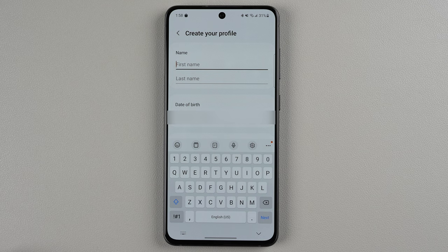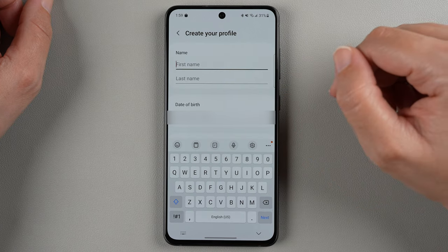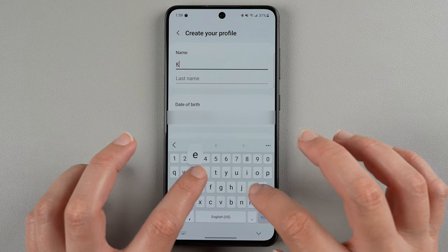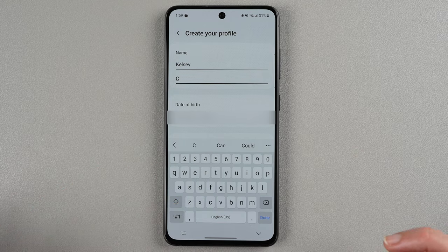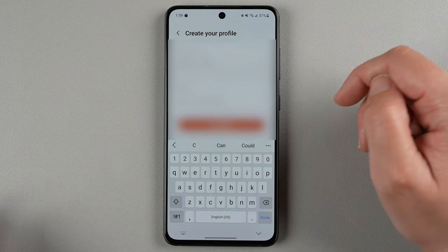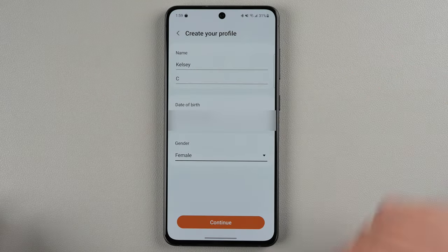It's asking to create a profile, which is interesting because they should already know this information, but I guess they want this for what it will print out on a PDF to send to your doctor — that kind of thing. So I would go ahead and put in your name, your date of birth, and whatever your gender is, and once you've done all that you can go ahead and tap continue.